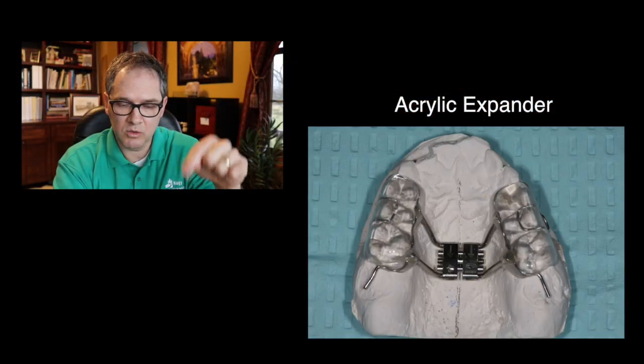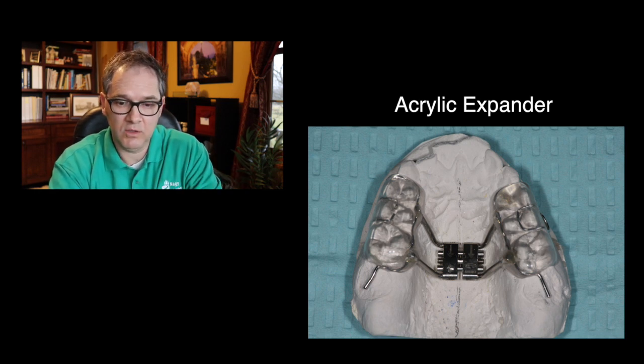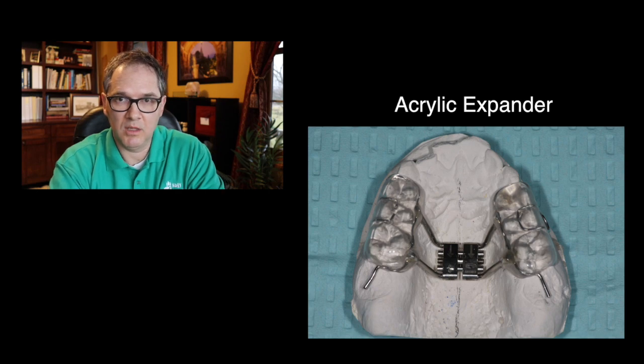So I encourage you to talk to your lab and get specific information on the screws that they have used for your expander, and then you figure out the number of turns, and then you won't have the problem of under or over expanding. And if you use an acrylic expander, before you cement it, maybe drill a hole through the acrylic over the mesiobuccal cusp, or just put a mark, like a little dot where the mesiobuccal cusp is, so you can see how much you have expanded, and you can evaluate it and make sure you're not underexpanding.